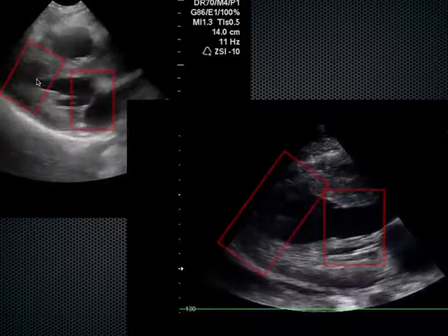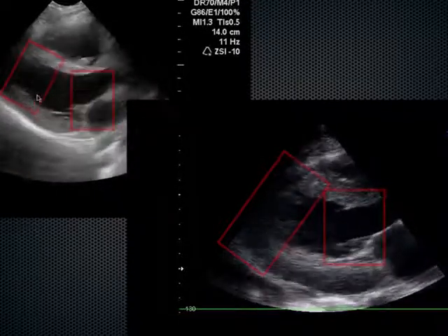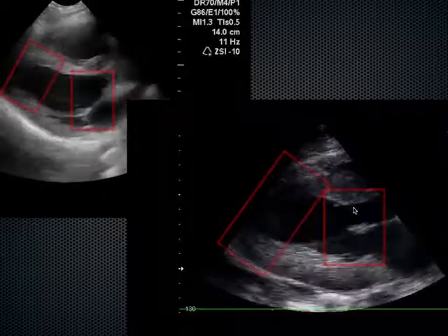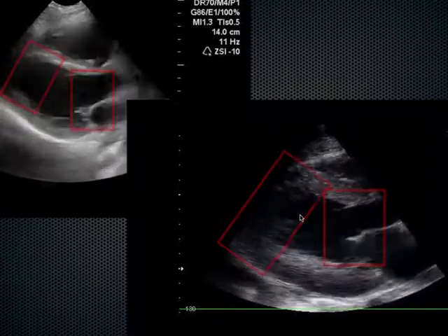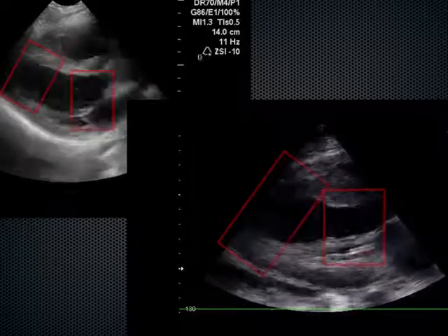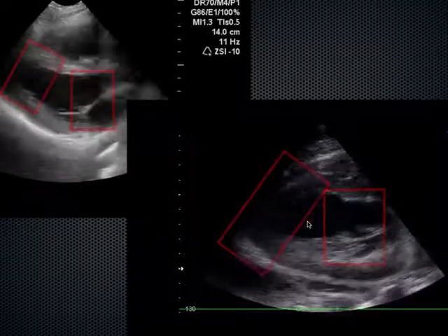Okay? Now, let that play, and then I'm going to look over here at the interventricular septum and the posterior wall. Pretend you're a little red blood cell sitting right here, and you would get squeezed right out the aortic outflow tract, right? Because these two things are compressing, squeezing you right out the aortic outflow tract. Down here, though, we've got a couple problems. First of all, this mitral valve is not coming anywhere near that septum. Number two, the interventricular septum and posterior wall are not squeezing the red blood cells out of the aortic outflow tract. So just right off the bat, if both these patients had a blood pressure of 70, I'm going to give this patient fluids, and this patient, I'm going to be very careful with fluids and likely lean on inotropic therapy.